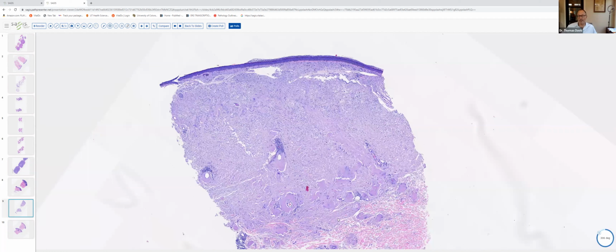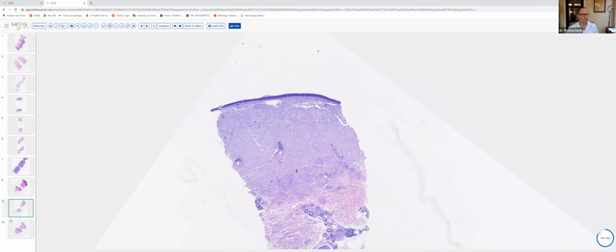We can confirm the diagnosis with the use of Congo red or crystal violet stains. Nodular amyloid tends to be associated with an infiltrate of plasma cells because it is light chain derived amyloid. This can occur solely as a skin finding or in the setting of systemic amyloidosis. So nodular amyloid: large deposits of fissured pink material and an associated infiltrate of plasma cells.